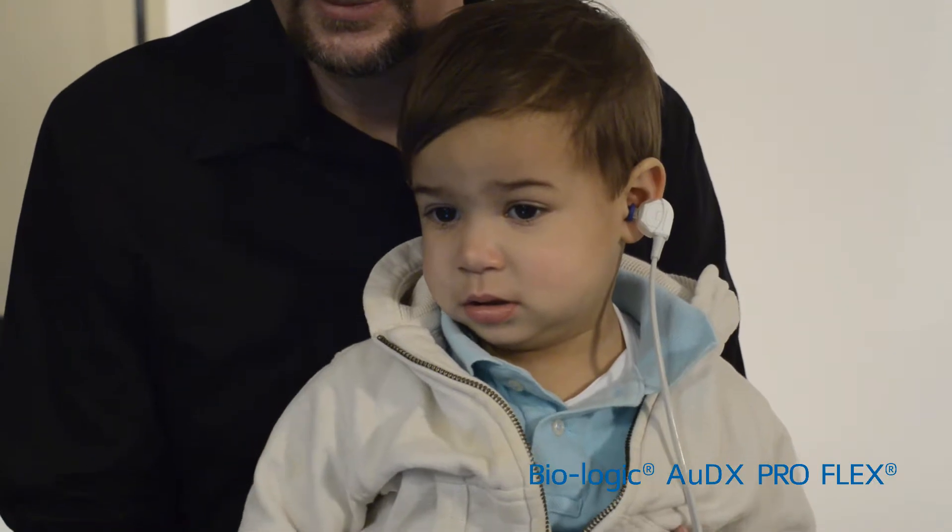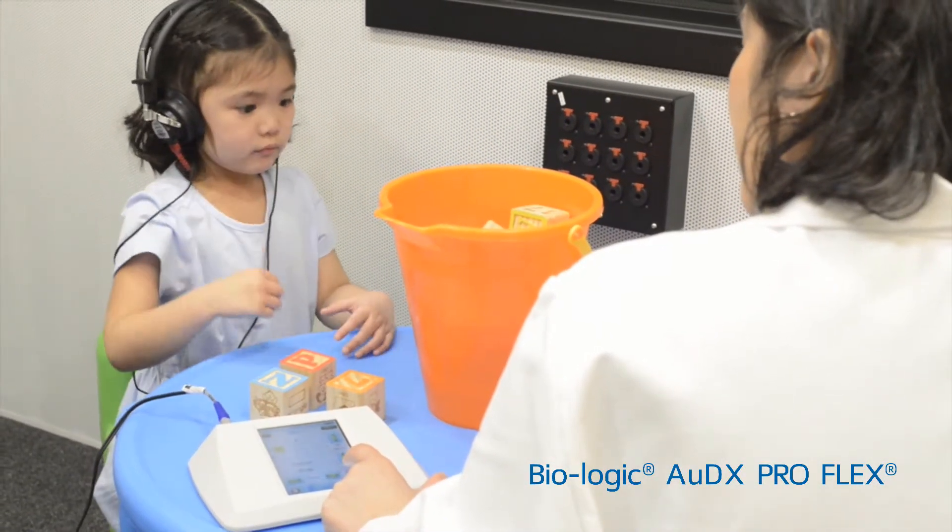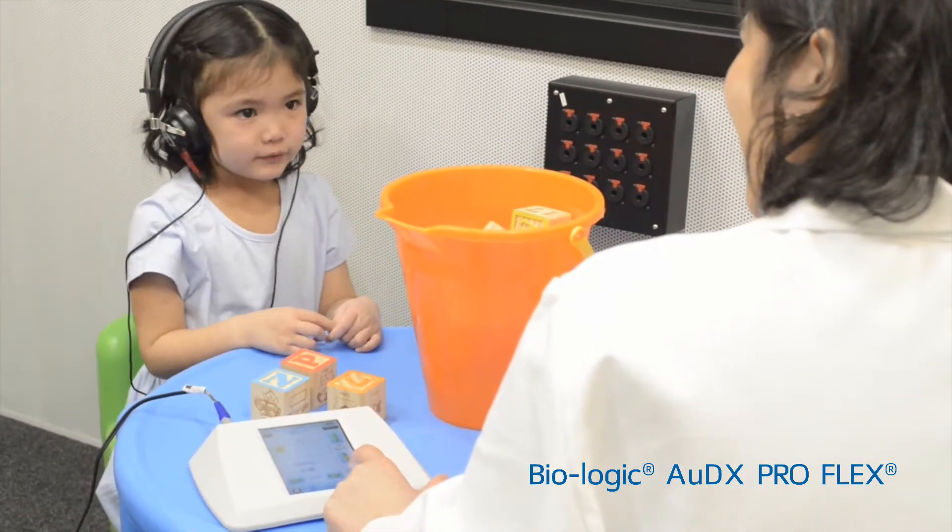The light feature on the visual inspection probe allows for the probe fit to be monitored throughout testing. Audix Pro Flex is battery-operated, lightweight, and portable, allowing for easy transport to the patient.